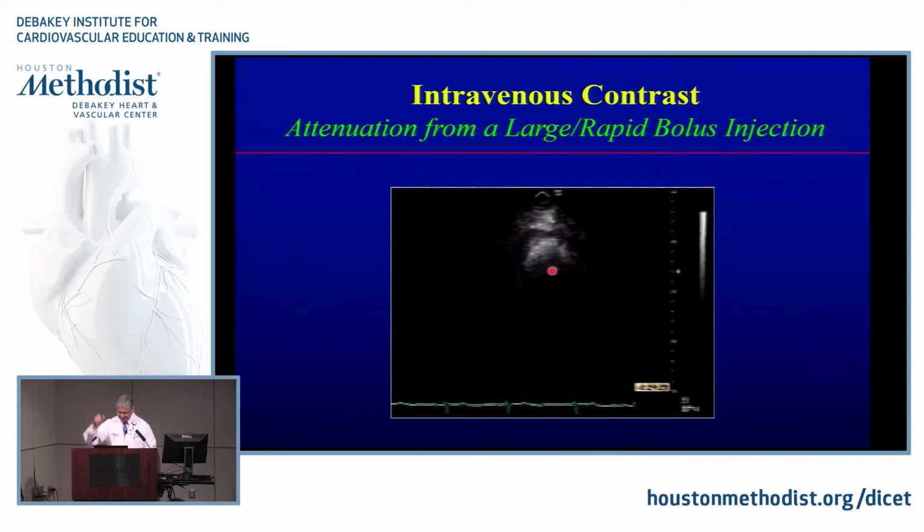We got it. Okay. But this is very important because then you understand if it is too much or too little. If I'm seeing this, usually the concentration here is quite white, and behind it is black. What you can do is just wait a little bit. I said, oops, I've done a little too much contrast. Wait a little bit. You can destroy it a little more with ultrasound, or just wait a little bit for it to diffuse, dilute, so this bolus is not coming in all at the same time.